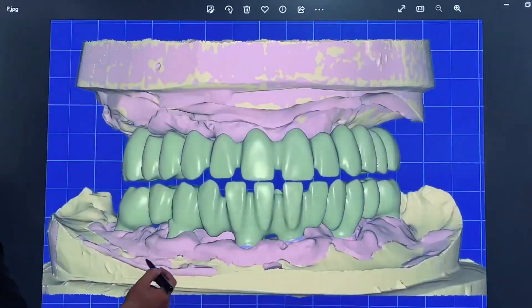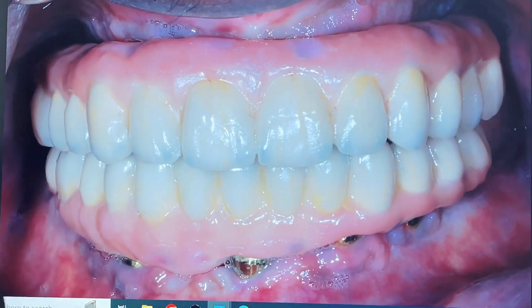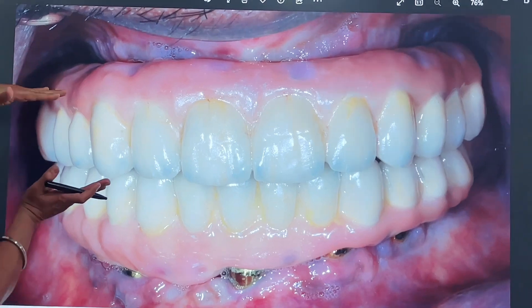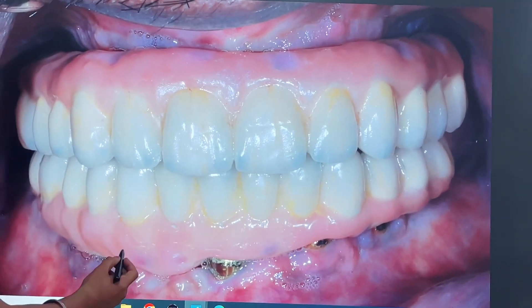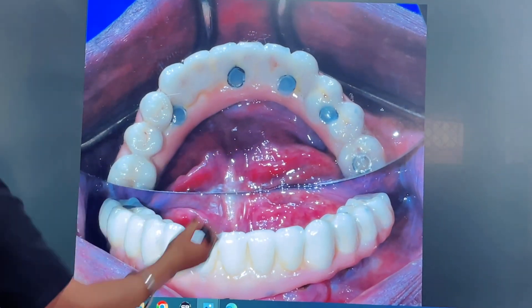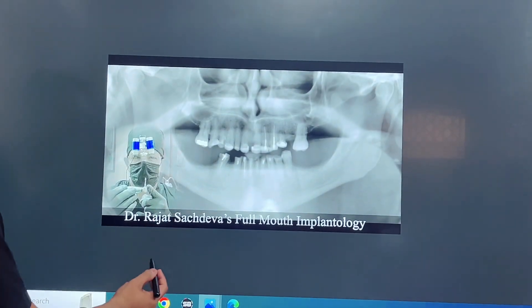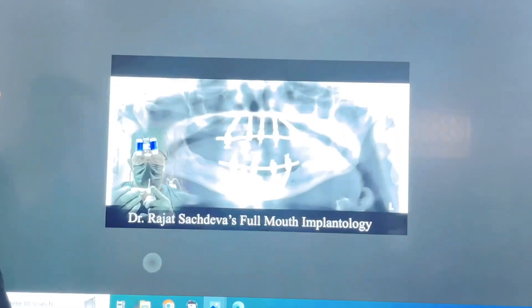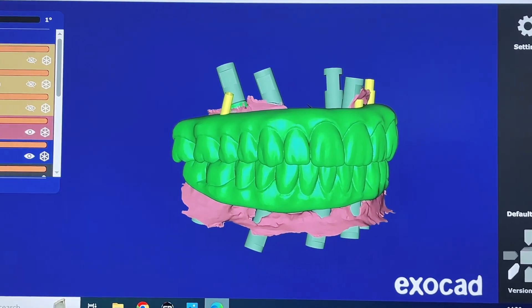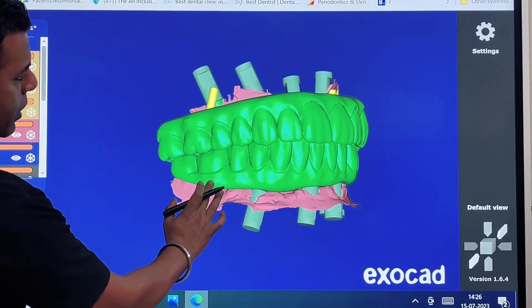After that, we proceeded — this was how we designed the whole case. This occlusion was full-mouth implants: very good occlusion, left and right, with a good midline and good balanced occlusion. You can see the final occluded smile — it is very important that you plan for any implant case. Have a look — it is such a beautiful occlusion.